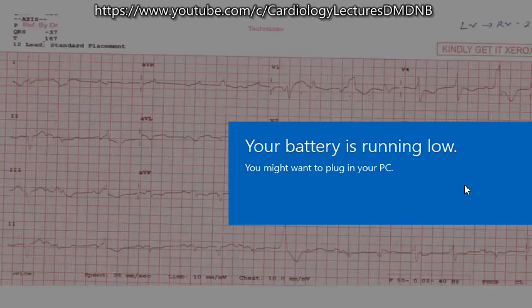This was the ECG of the patient when we saw the patient for the first time. If you walk through this ECG, this is the only paced complex, with an initial R in lead V1. This is the intrinsic beat somehow. This is the PVC, I'm sorry. And the post-PVC beat, I think, is faster than the maximum tracking rate. The device has not tracked it. So this phenomenon was getting repeated, and the patient was not getting adequate BiV pacing.